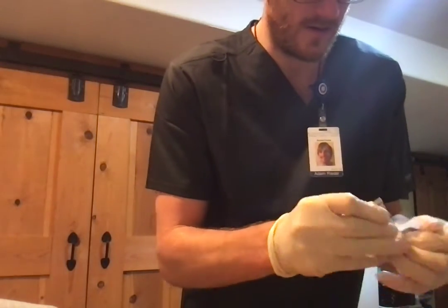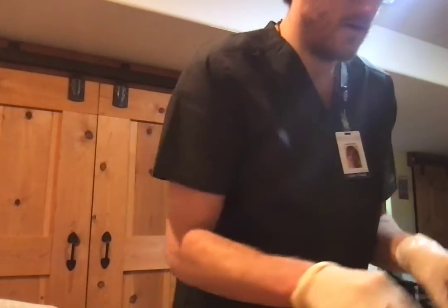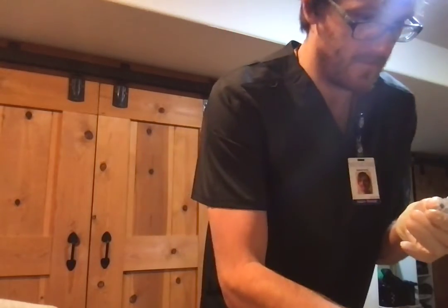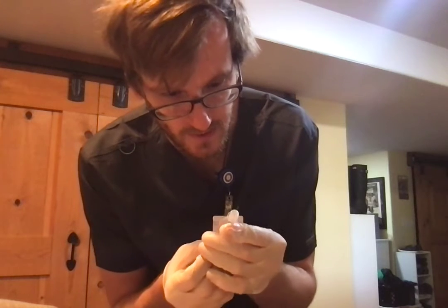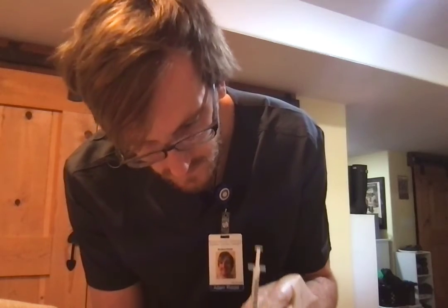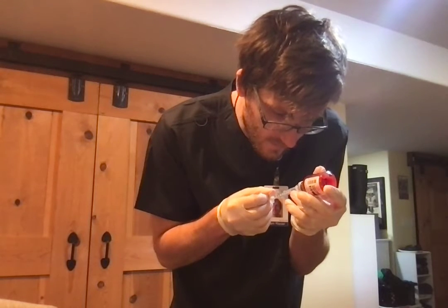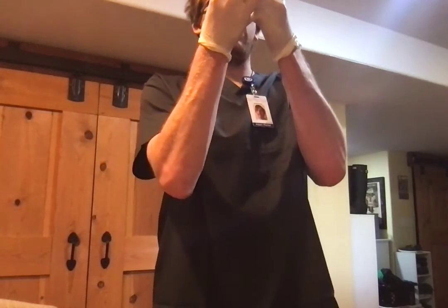So, get my alcohol swab and wipe the top of my vial and get my 1 mL syringe out. And before I puncture, I'm going to draw some air into there at 0.1. And then we'll release that air, and then our order was for 0.1 mL, so we're going to slide it up to 0.1. And then I want to go ahead and tap the syringe lightly to get the air out.